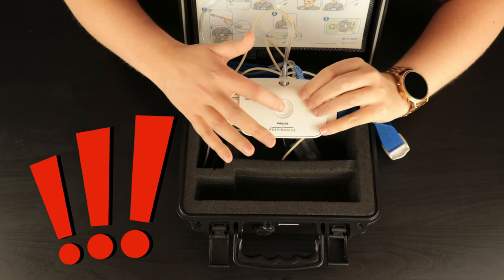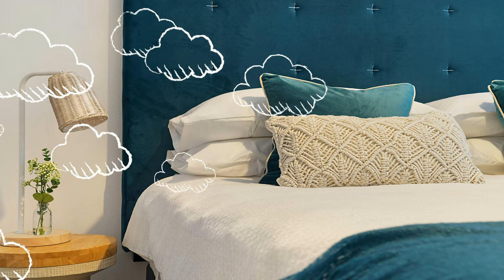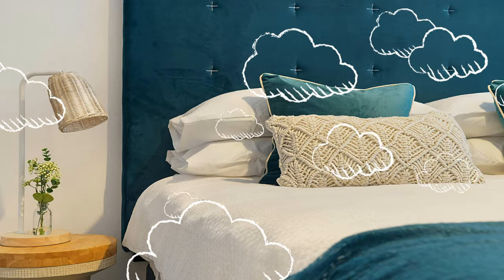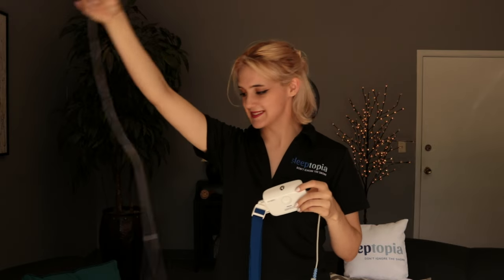Do not press the button in the middle, to ensure that there is enough good test data. Now you are ready to go to sleep. Please make sure to wear the device all night. In the morning, detach the chest belt, throw the nasal cannula away, and put everything else back in the box. Your sleep specialist has designated a time for you to either drop the device off at our office or have one of our technicians come to your house and pick it up.